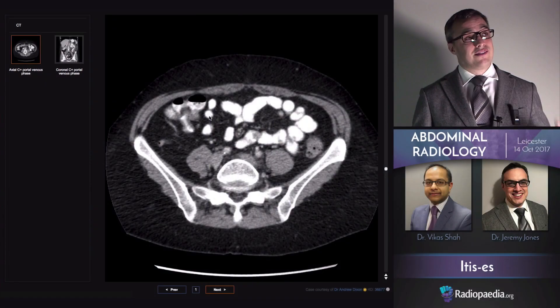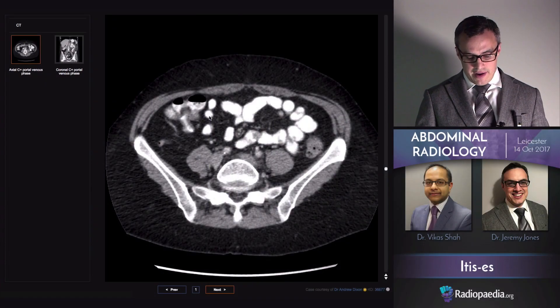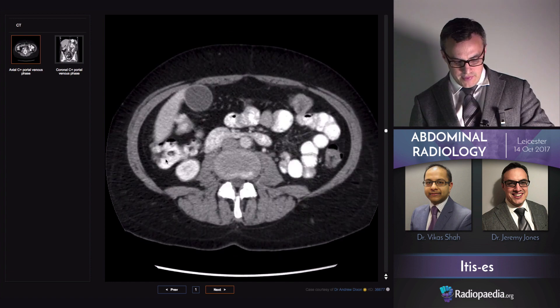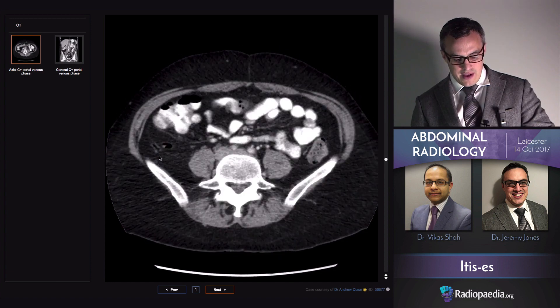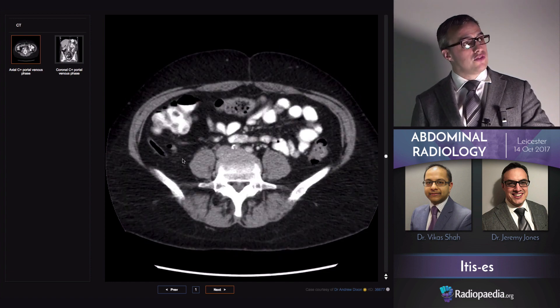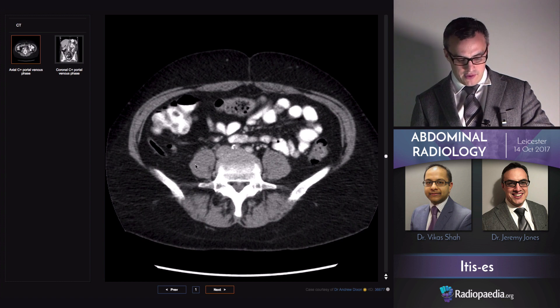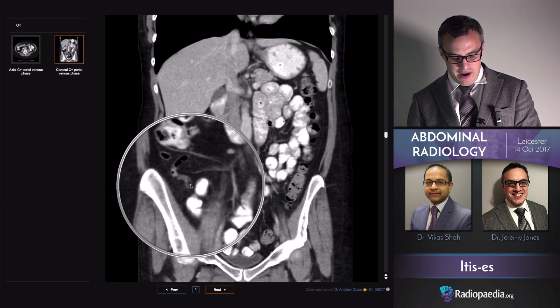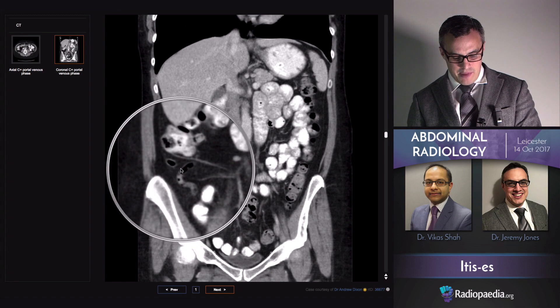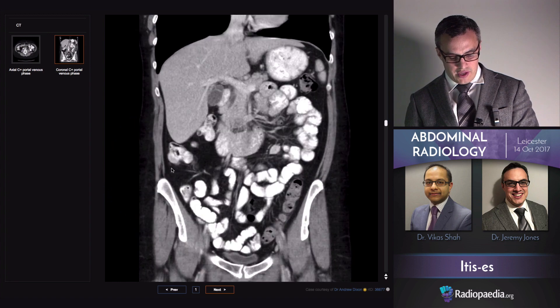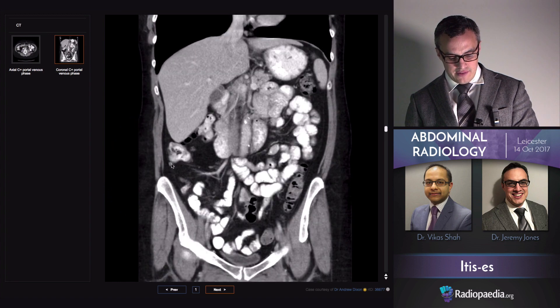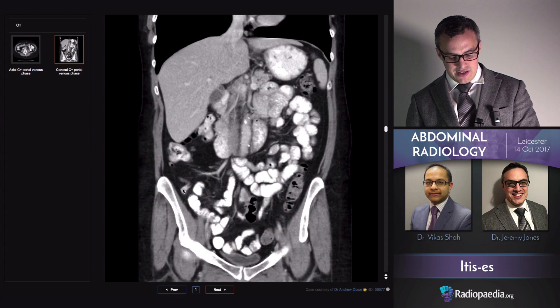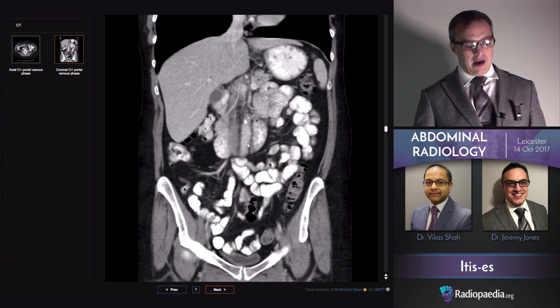We don't always use ultrasound to look for appendicitis, and the reason is that sometimes we can't find it. The appendix often sits down in this area of fat, lateral to the psoas. And here it is — a little wiggly worm of a loop of bowel that heads back up towards the caecal base and ends blindly, just in this case up against a piece of small bowel.